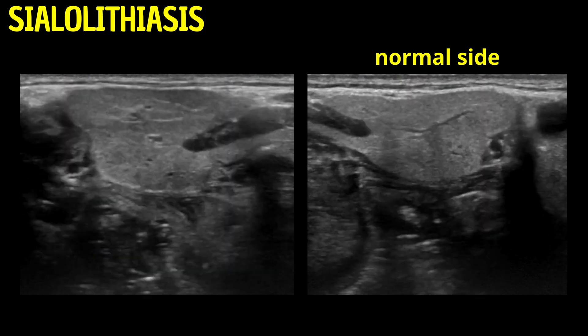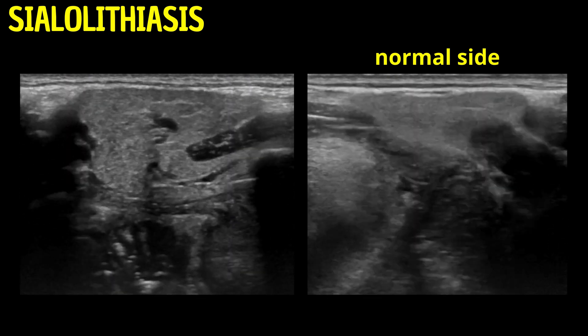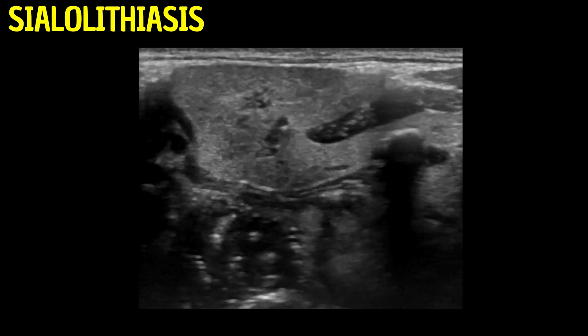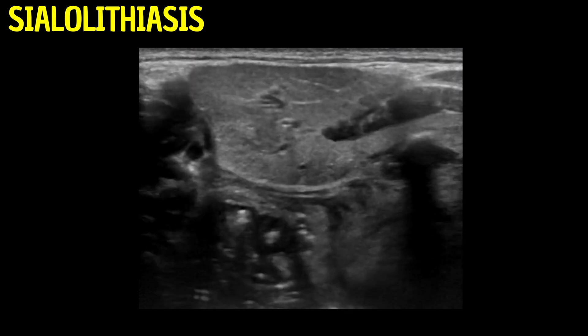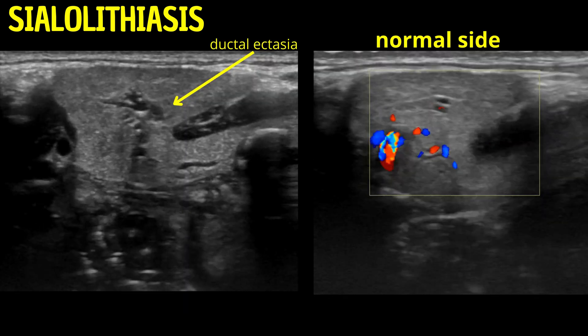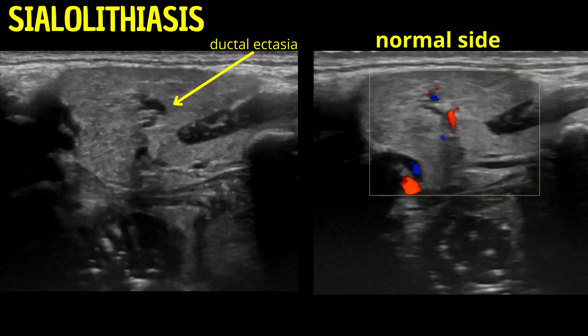As we progress to the second scene, a mild intraglandular ductal ectasia becomes apparent within the same gland. This finding suggests an obstruction within the ductal system, prompting a closer examination.